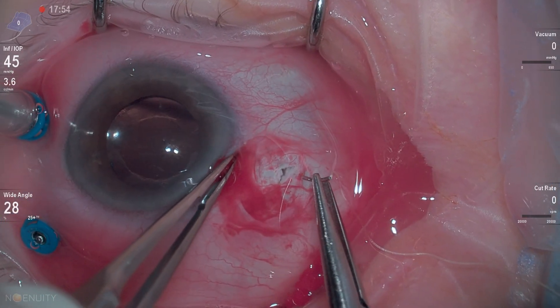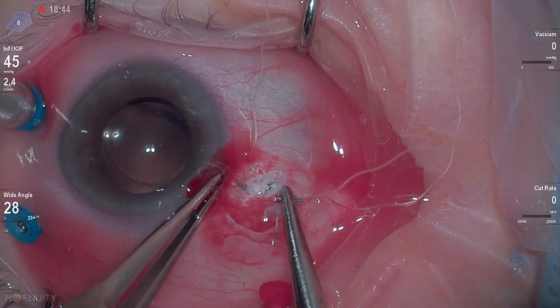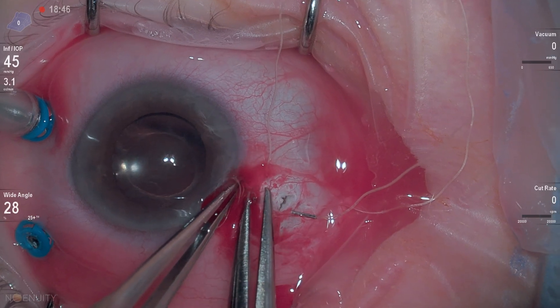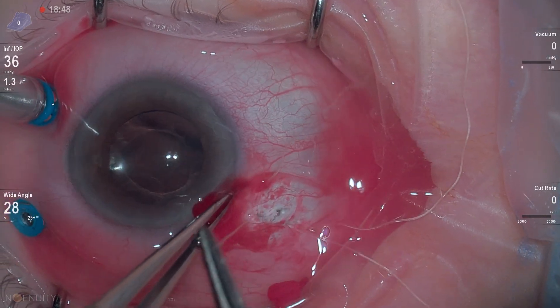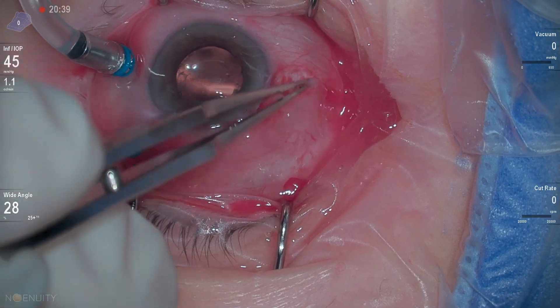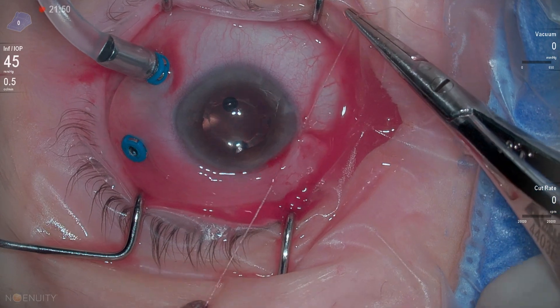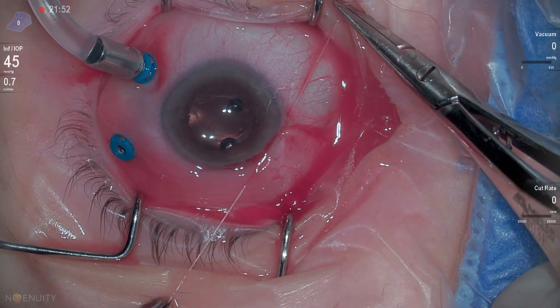Last but not least, we're closing up our sclerotomy and our conjunctiva as well. This really went well for this patient and they did very well. Do a good conjunctival closure — that's what your referring doctors are going to see. Thank you all for watching.